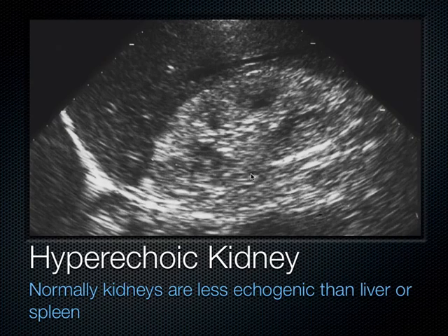You know, you pound on the patient's back, they've got some CVA tenderness, and pyelonephritis is diagnosed with that and an infected urine specimen. But here we see a kidney on ultrasound that looks very hyperechoic, and we see this commonly. Remember the cobblestoning that you saw a few slides back? The tissue looked very hyperechoic, very bright there, and that happens when you have infection. Things get more echo bright, or more hyperechoic.